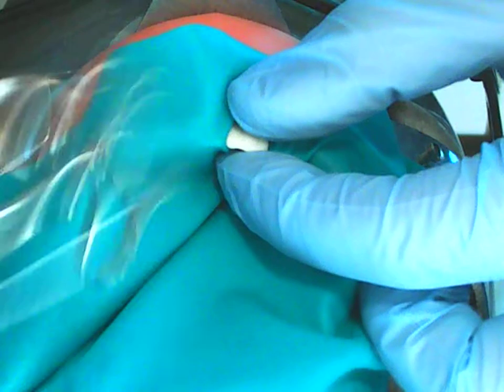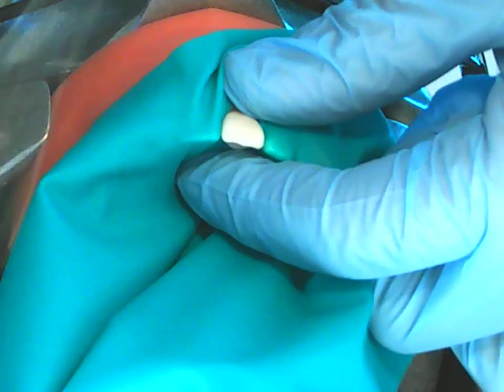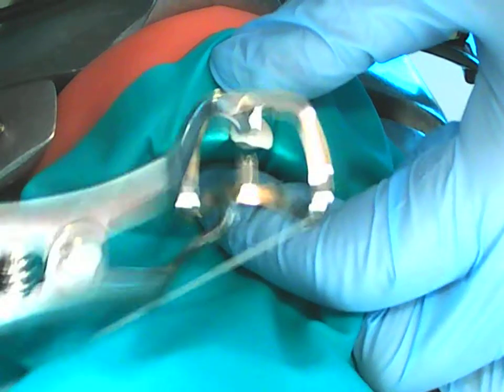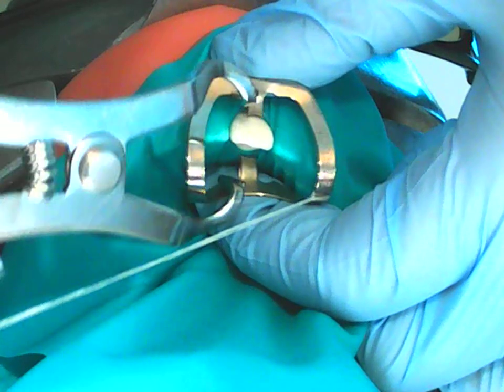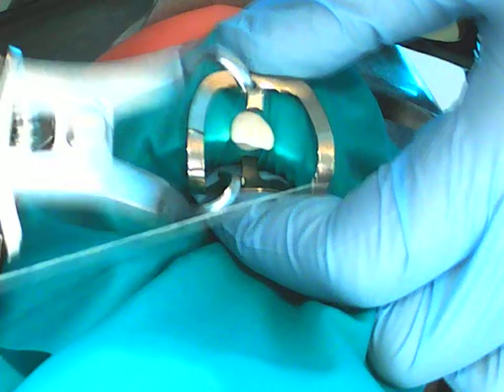Okay, so I have that in my dominant hand, the clamp with my forceps. I go back with my non-dominant hand, try to retract the dam, facial and lingual, as much as possible, and stretch open. Going to place it on the facial aspect where you can see directly first.